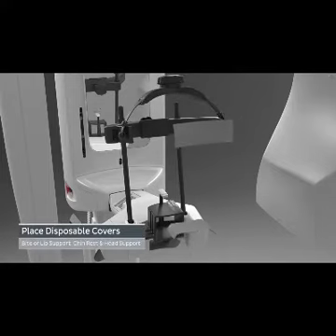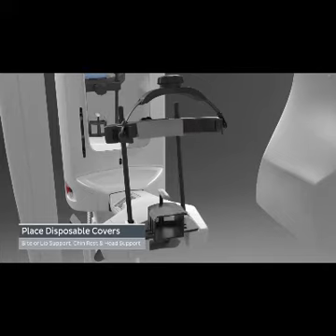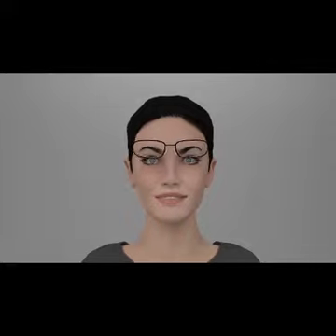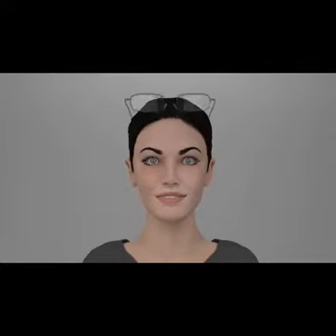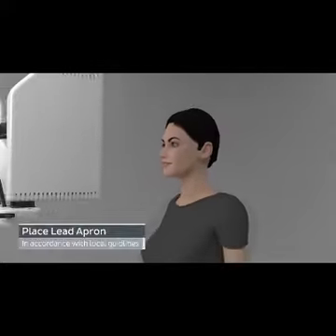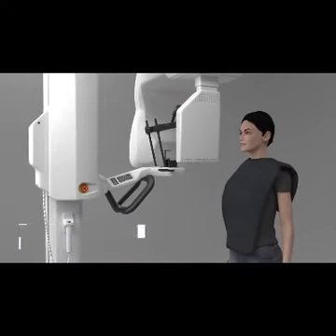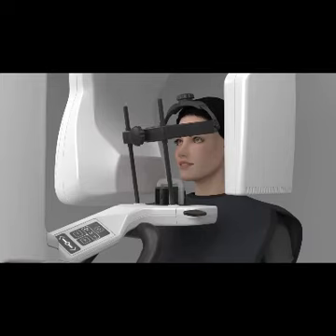Place disposable covers on the bite support or lip support, patient chin rest, and head support. Prepare the patient for the procedure by asking the patient to remove any metal artifacts, including earrings, necklaces, hairpins, or removable appliances from the shoulders and above. Properly place the protective lead apron over the patient in accordance with local regulations. Have the patient stand in front of the unit.